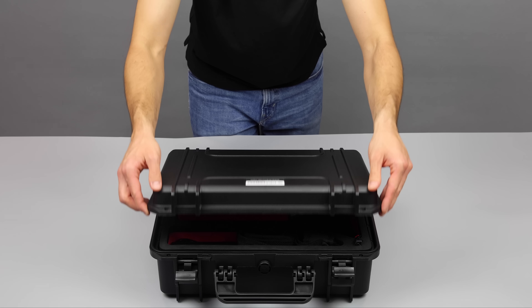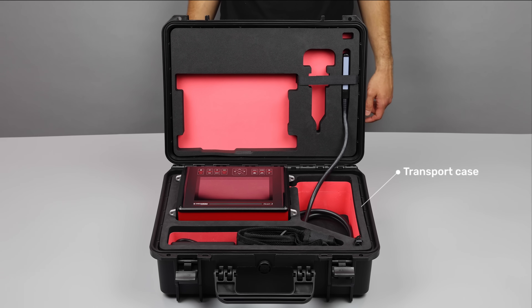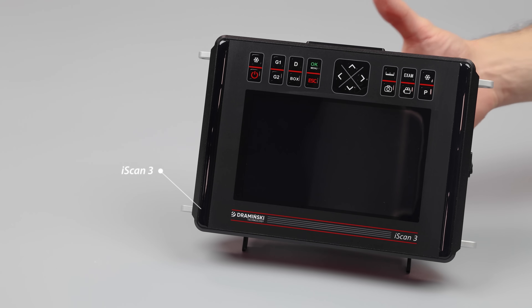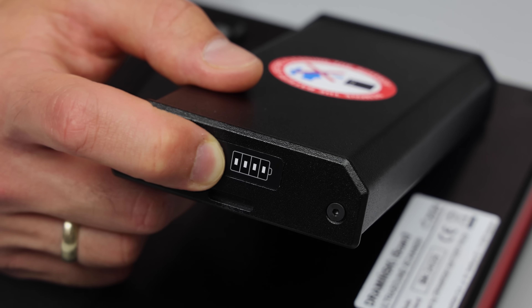The set arrives in a robust transport case designed to protect the iScan3 from any damage during transport. Opening the case, you'll find the iScan3 ultrasound scanner along with several essential accessories, including an external battery for extended use in the field with a charge indicator.